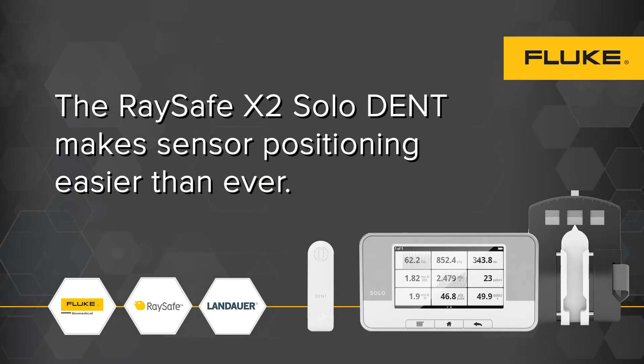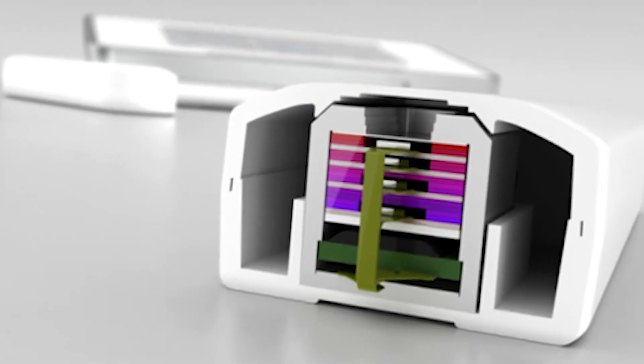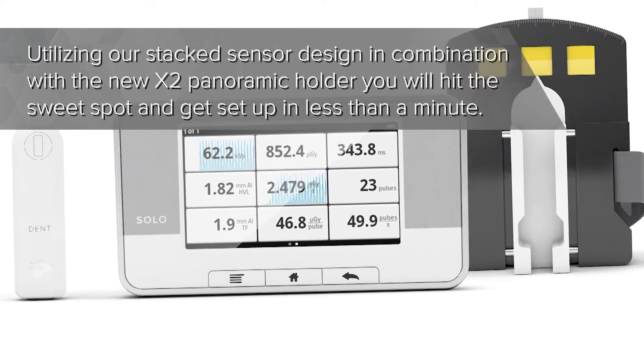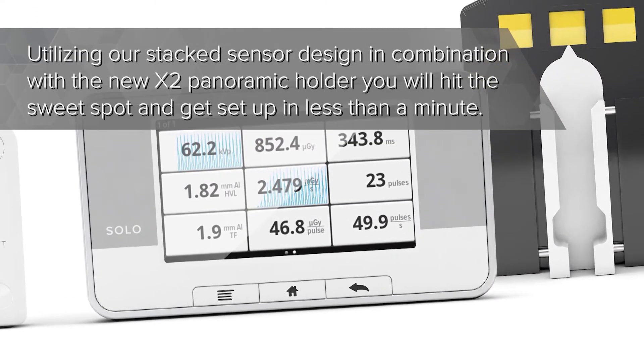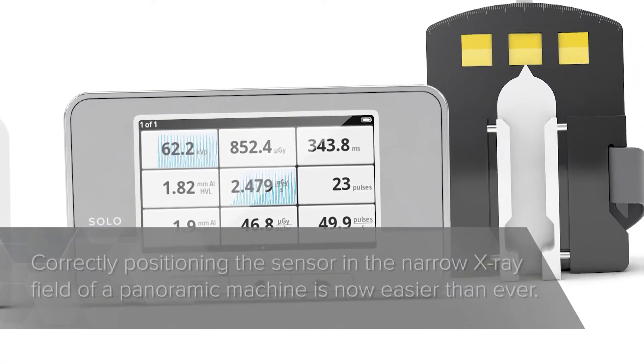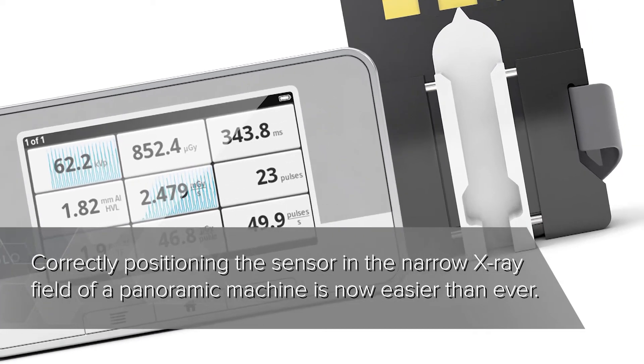The RaySafe X2 Solidant makes sensor positioning easier than ever. Utilizing our stacked sensor design in combination with the new X2 panoramic holder, you will hit the sweet spot and get set up in less than a minute. Positioning the sensor correctly in the narrow X-ray field of a panoramic machine is now easier than ever.